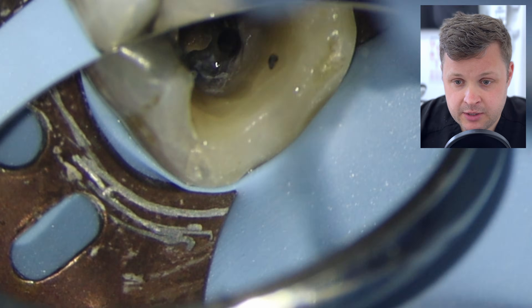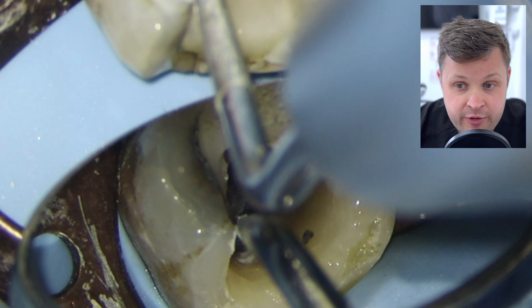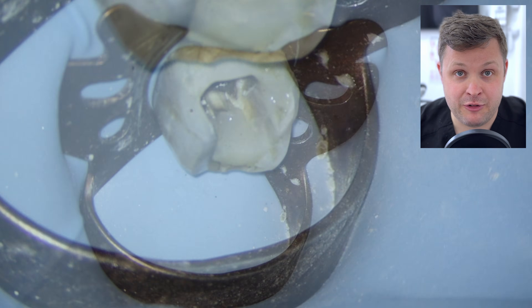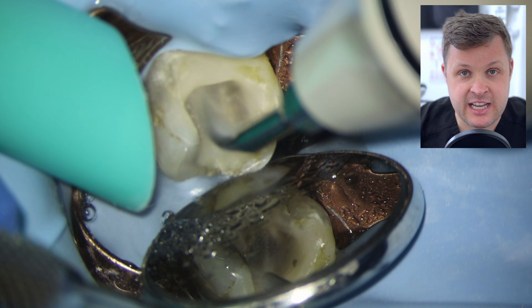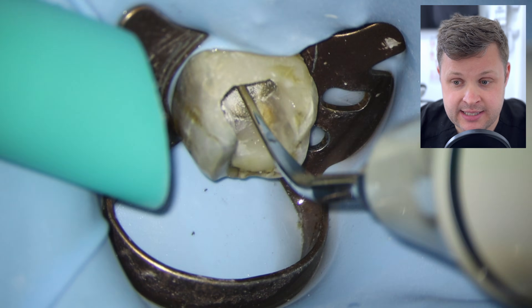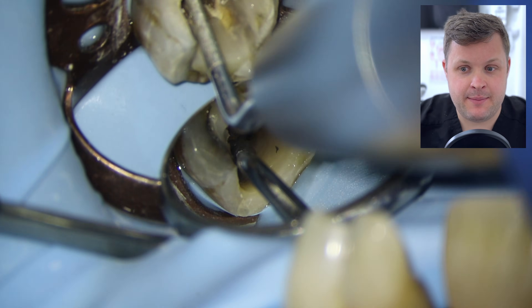I'm going to use endo diamond-tipped ultrasonic tips to carefully remove the composite shelf — super carefully, without irrigant, so I don't overheat the tooth or break the tips. When not careful with dry tips the patient can actually feel the heat. Then I use high-energy ultrasonic tips to try to break the orifice open. Sometimes the tip just drops into the canal space, and it's a succession of high and low-energy ultrasonic tips. Occasionally I need the fast handpiece to remove bulk composite if a ledge forms.